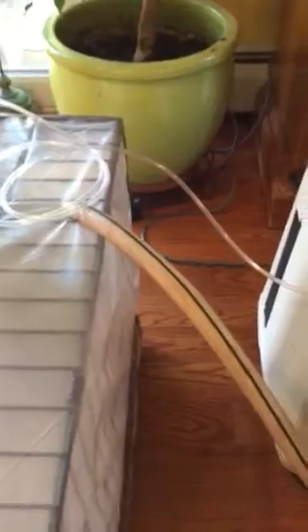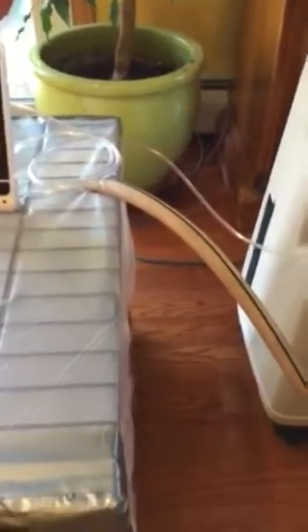Now you're also going to see here is I have a garden hose. You're probably wondering what that's for. Well, and that's going in on top of the cage also. What I did is the cage was getting warm. It actually went up to about 80 degrees with the dog inside. Now what I did is I have my air conditioner close by. I cut the garden hose and I put one end in the cage, and as you can see over the other side of my kitchen I have the air conditioner.